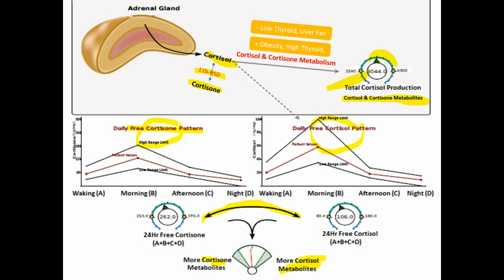In a case like this, where the overall cortisol picture is low, if that favors more of cortisol, that might be seen as more of a mechanism of the body sort of trying to hold on to that low level of cortisol so that it's not readily deactivated, and that might make sense in somebody who's got low levels overall. On the other hand, if there's more of a preference to push that cortisol away towards the cortisone, then it might be contributing to some of the low cortisol symptoms. Not only is there a low production overall, but if there's also a heavy deactivation towards the inactive form, cortisone, then that may exacerbate low cortisol symptoms. So you want to look at the overall picture, of course, the clinical picture, the free cortisol over time, the total production, and any metabolic preference that there might be.